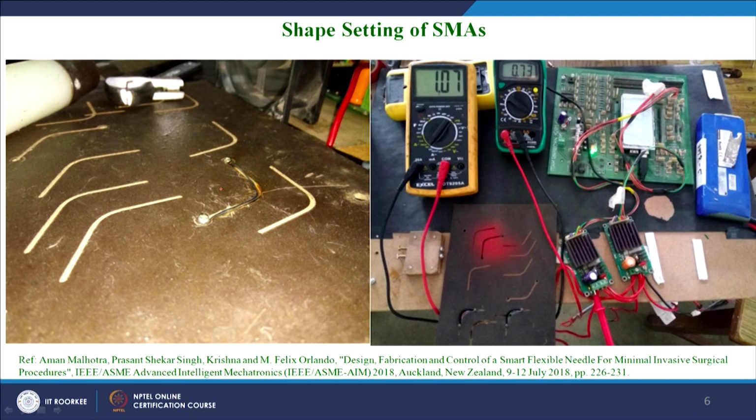We first heated the system to 90 degrees Celsius, and we gave it this shape, so that after cooling it can be deformed into any other shape, and then by heating it, it will come back to its original state, which is the memory it has due to the phase transformations that happen in the crystalline structure of this shape memory alloy wire.